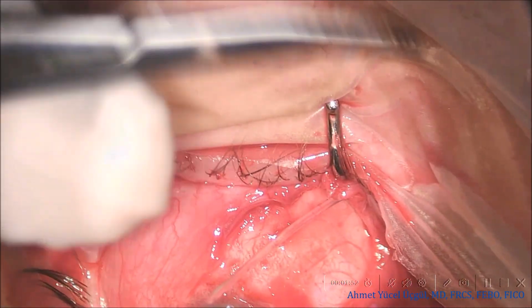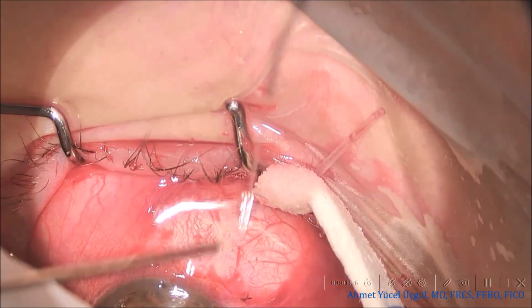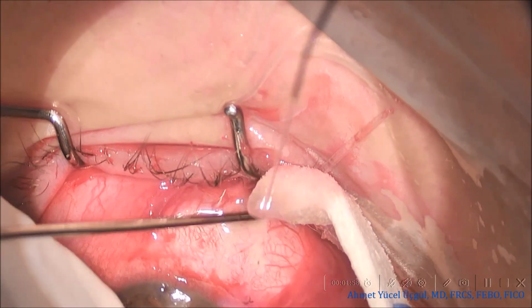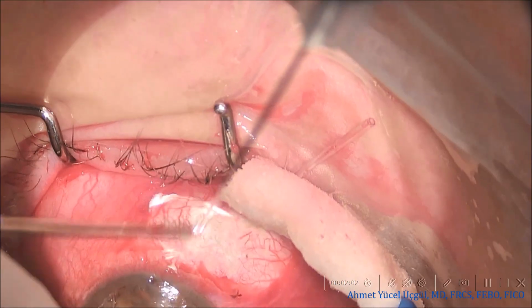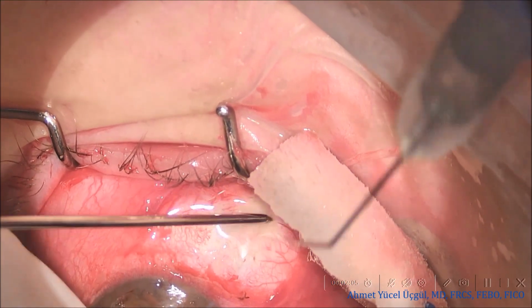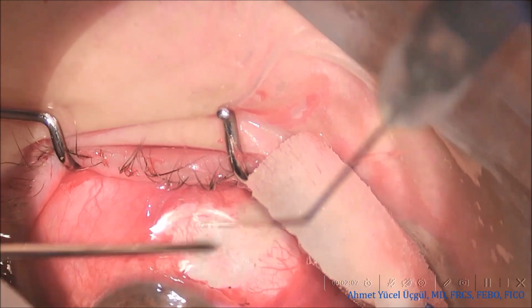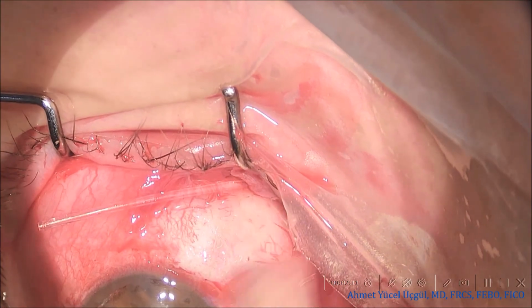As in the previous case, cautery is performed with the lowest effective energy under continuous irrigation to achieve hemostasis while limiting thermal injury. Keeping the sclera well hydrated at this stage is essential. Since the sclera contains a high water content, drying causes it to thin excessively and develop a blue color. In that condition, controlled dissection for flap or tunnel creation becomes extremely difficult.